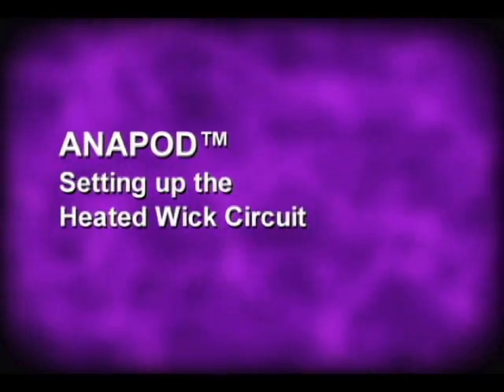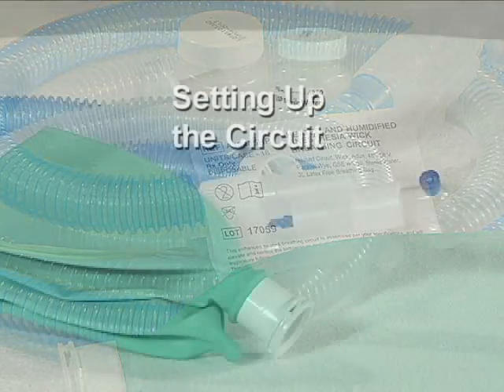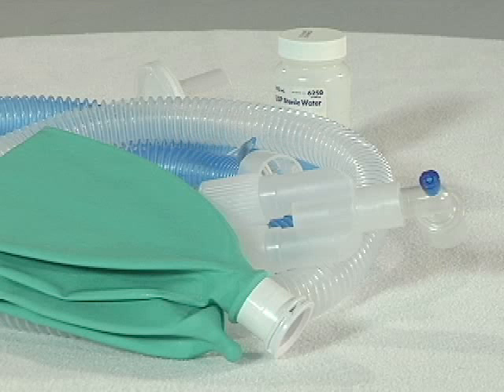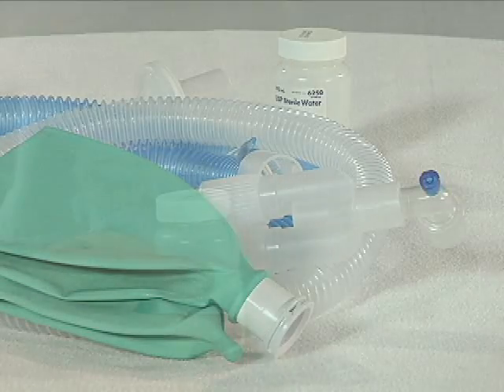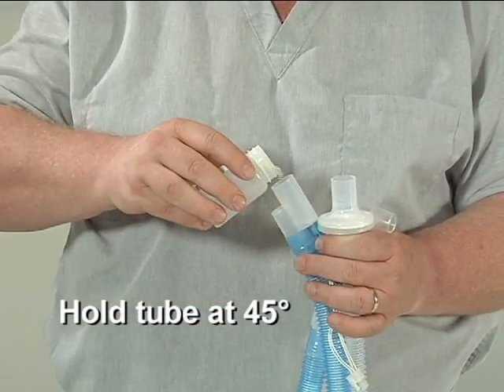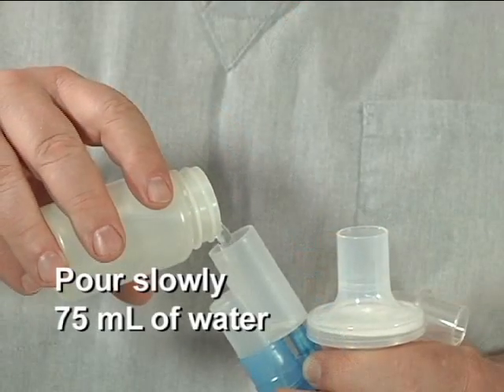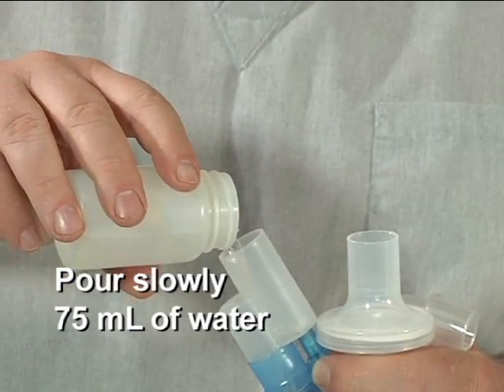Setting up the Anapod heated wick circuit. Ensure the Anapod humidification system is set up correctly per the individual circuit product to be used. Specific instructions for use of the breathing circuits are provided in the individual packaging. To set up the circuit, add water from the enclosed sterile water container. Remove the screw cap and sterile cover from the water bottle. Hold the end of the tube at a 45-degree angle and pour slowly approximately 75 milliliters of water into the opening that connects to the anesthesia machine.